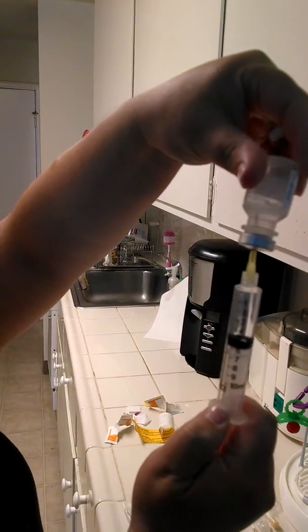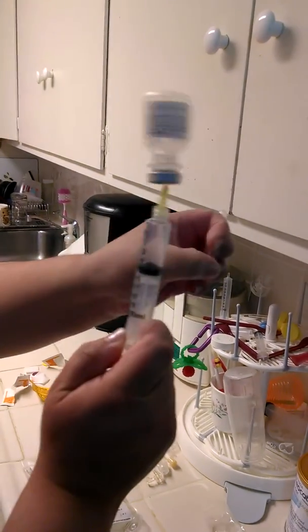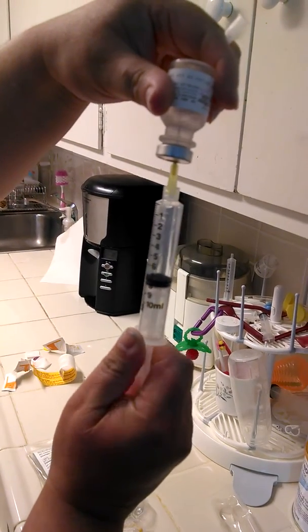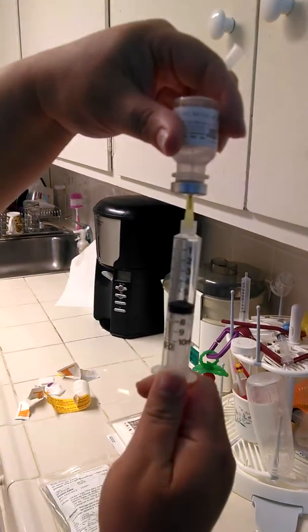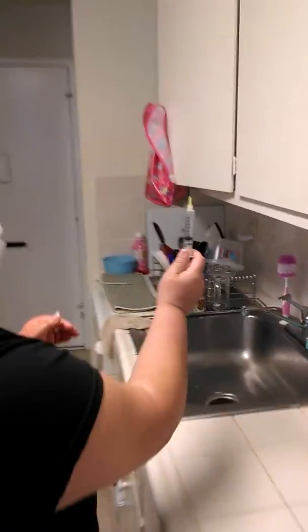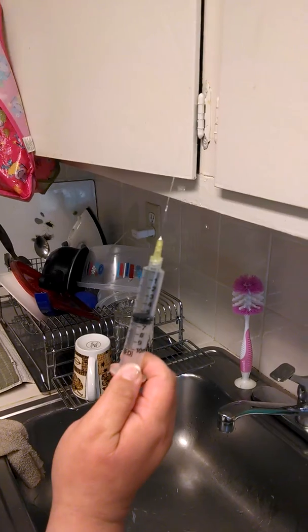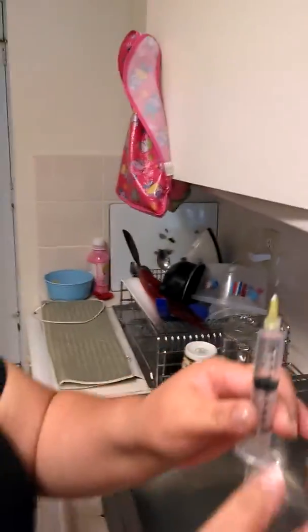Five mls of sterile water. You've got some bubbles there — you can work those out. I'm taking out six and a half, that's my dirty area, and I'm going over to the sink. I want to get all the air out, so I just tap it and pour the excess in the sink. And there we go — five mls of sterile water.